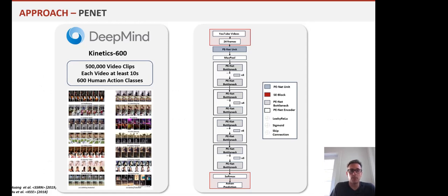And so we sought to create a 3D model to look at this problem because, again, it's a multi-slice problem. Just as many groups do, we focused on building a supervised modeling approach that could identify pulmonary embolism with high degrees of accuracy at the expert level. The existing approaches in the literature tended to use extensive, computationally expensive pre-processing and feature engineering, which were over-engineered and really not capable of end-to-end inference in a clinical workflow.